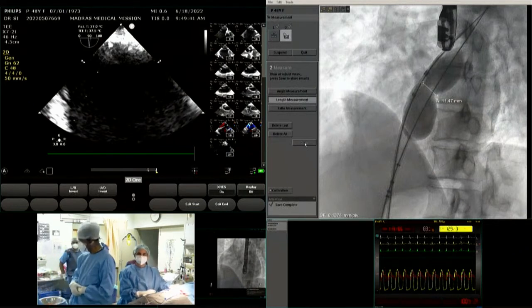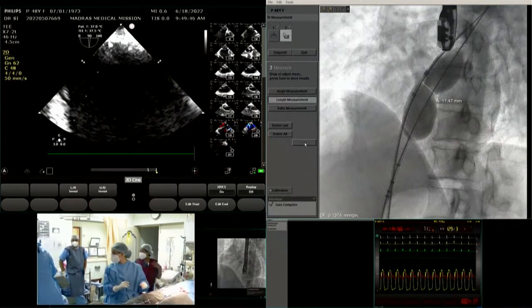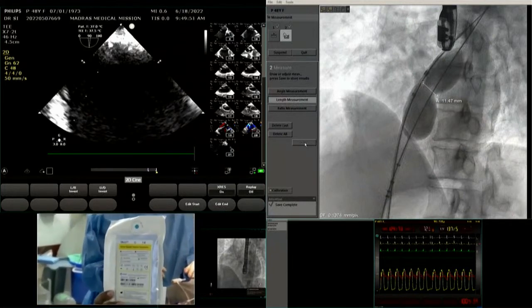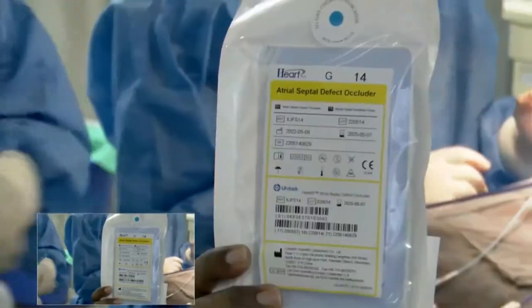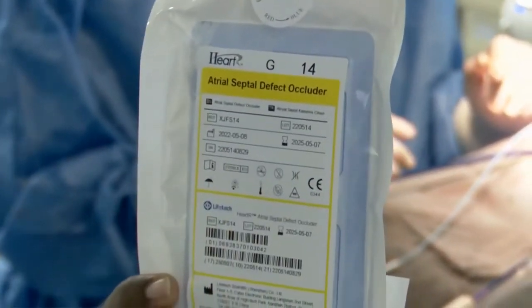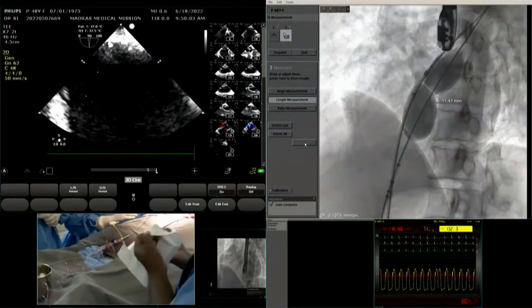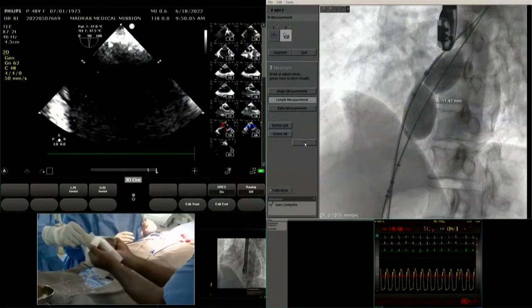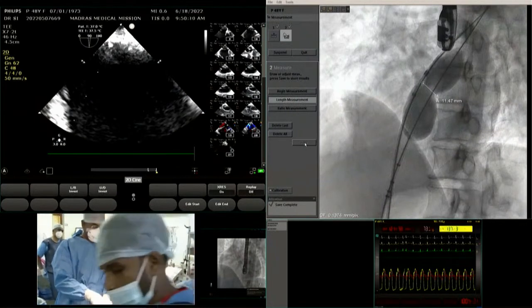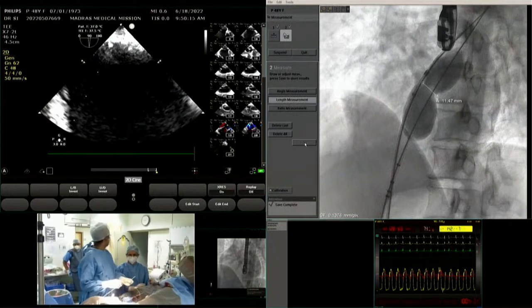Shiva, do you suggest to use the balloon in a patient with a floppy septum and a single defect? No, that we don't use it, Bhavesh. Actually, I strongly agree with Nageshwar. We have completely come out of balloon sizing for a routine case. The cases where we do a balloon sizing are, number one, this double ASD where we do it always. Number two, in patients where we expect a restrictive LV physiology. Number three, in a patient in whom we expect elevation of the RA pressure due to either hypoplasia of the right heart or due to pulmonary stenosis.